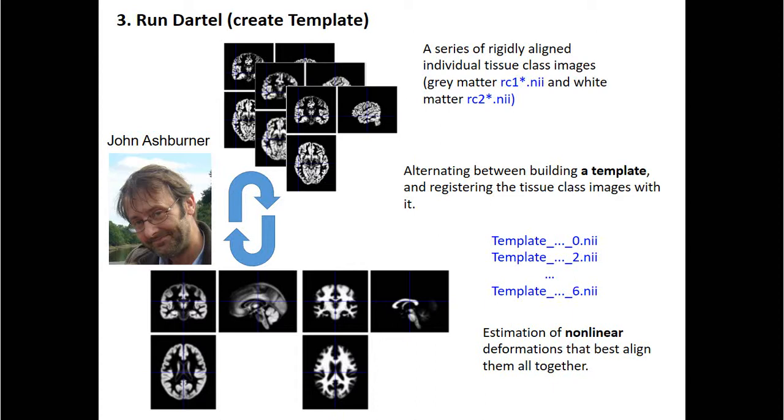You have the same question, because in our case, we do segmentation without using a template. So basically, you have a Gaussian of everything that is included in the gray matter. So basically, you create 2 peaks, and then you decide on the threshold where you put it. But this is semi-manual. This is automatic. And they have multi-Gaussians for each of these two classes. And then you decide the threshold. And they use priors. Not necessarily. Here they use priors. In our case, we don't use priors because we don't have a template.